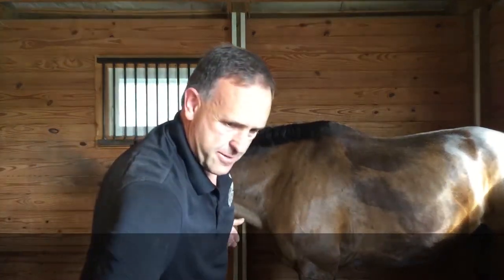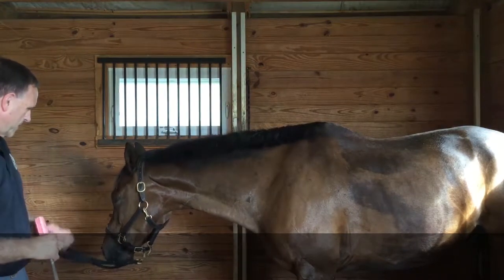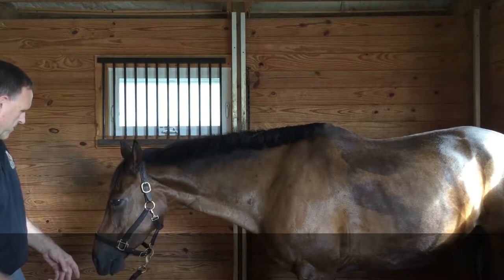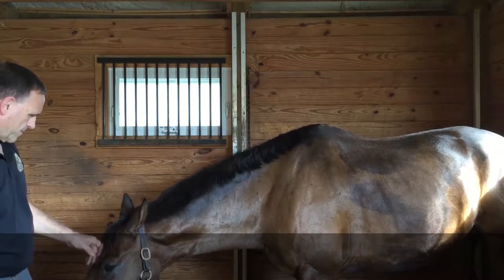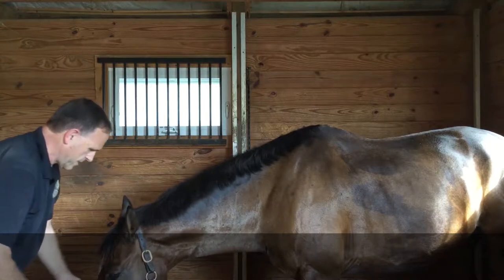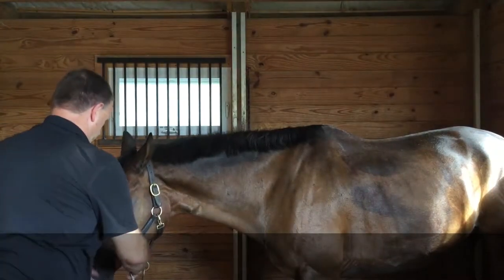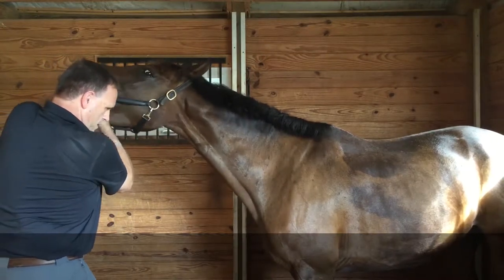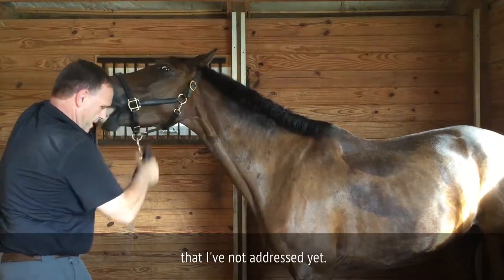We'll rinse that off. We'll finish off the bottom cheek teeth. Let's make sure I've got all the hooks and crannies done.